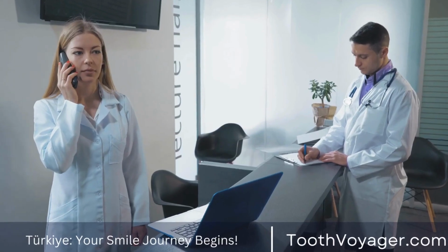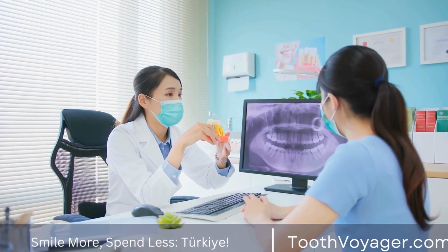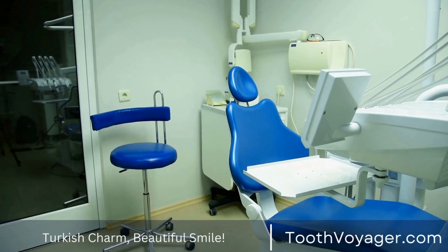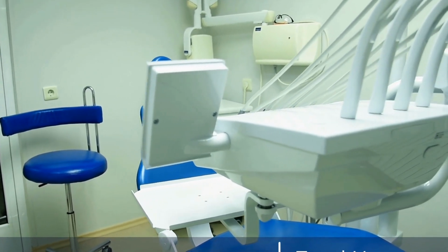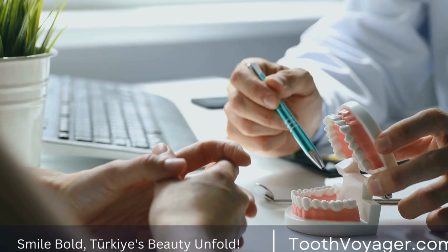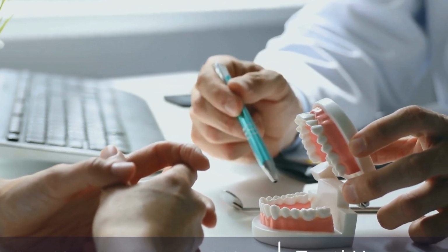4. Osseointegration. When the implant is implanted, a process known as osseointegration takes place. This is the process whereby implants fuse with surrounding bone tissue, forming a solid foundation for permanent dental restoration. It can take several months to finish. During this time, the patient might be provided with a temporary dental restoration.